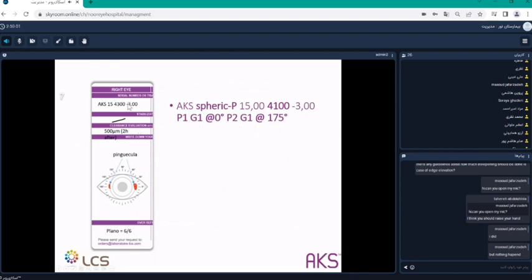And you also have to take into account the fact that you have an excess of clearance here. It says that you have 500 microns of clearance after 2 hours. This is too much, so you will need to decrease at least 200 microns. That is the reason why you finish by 4,100 microns. And so you can do that.